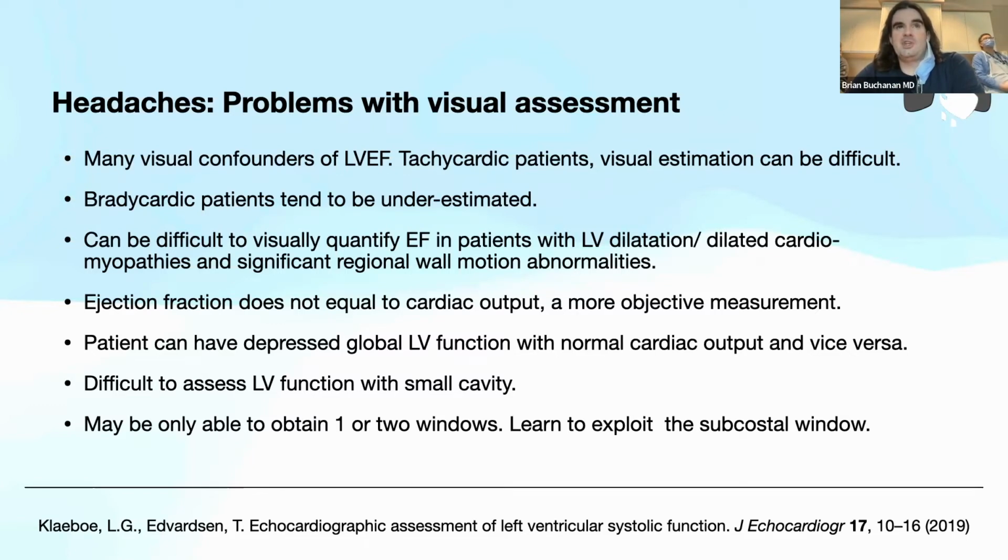And really make sure you learn to exploit other windows. I myself, and I'm sure Vince, you can say the same thing, have done a lot of unconventional views of the LV. That way you have a good assessment, because occasionally all you have is one plane, and you want to have more. So we certainly will look for views that are unconventional if our views are more limited.